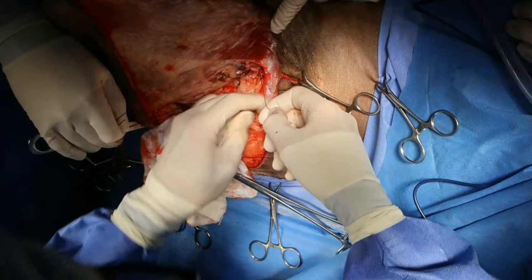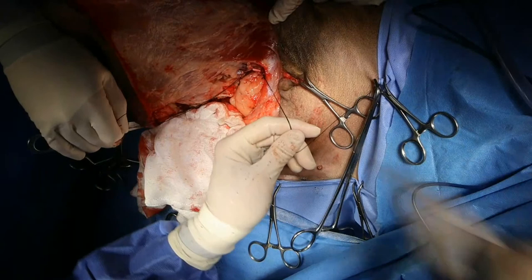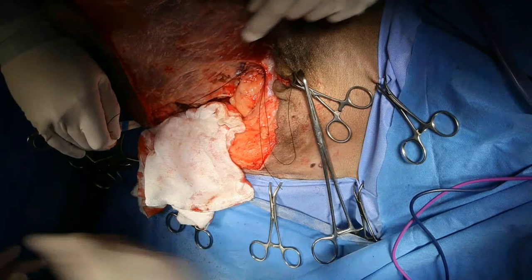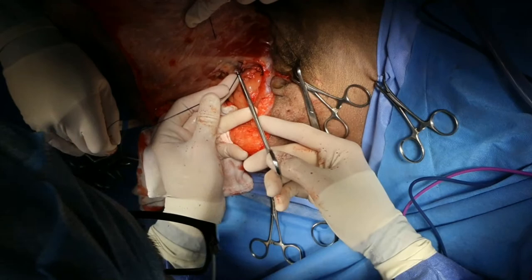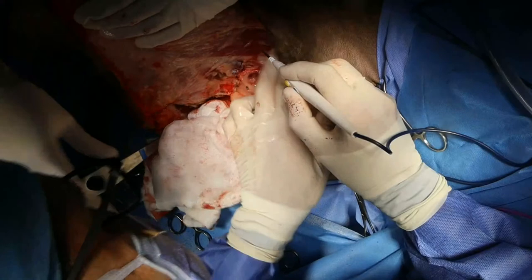Greasy. You know what I'm going to do with this is I'm going to ligature it as well. So that should be the majority of the blood supply in here, although you have to be careful because sometimes you'll have some weird aberrant little branches that you'll encounter. And I use the word encounter in quotes.